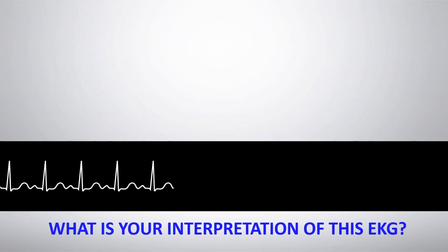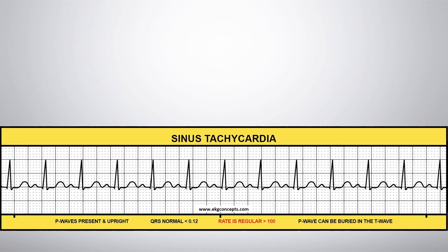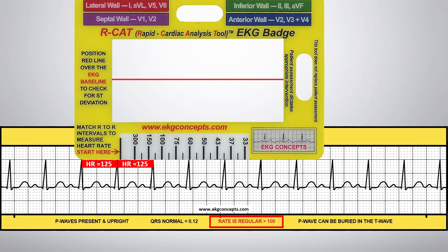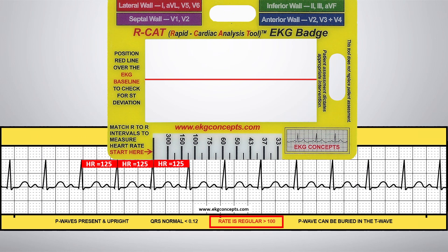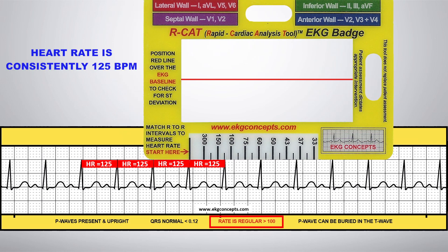What is your interpretation of this EKG rhythm strip? Sinus tachycardia. Using the EKG badge to accurately and quickly confirm, match the R-to-R intervals to measure the heart rate. You have a heart rate that is consistently 125 beats per minute.